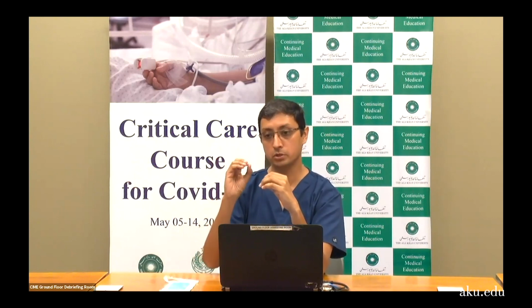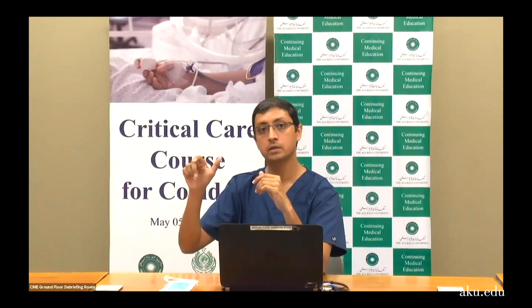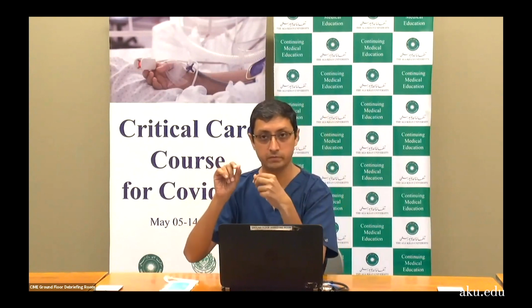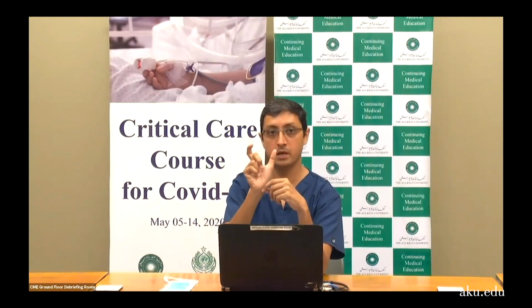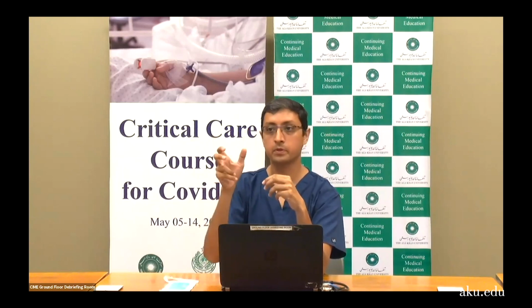I want the ventilator to keep on delivering air until the peak airway pressure reaches whatever you said, 14, 15, whatever it is. So with volume, tidal volume is guaranteed. 400 ml will be delivered with each breath, or 500 ml, whatever you dial up.